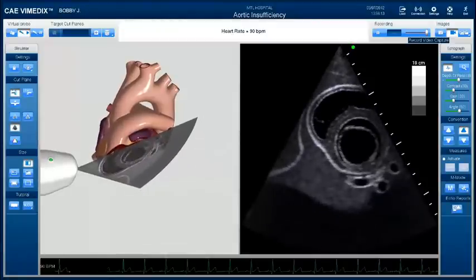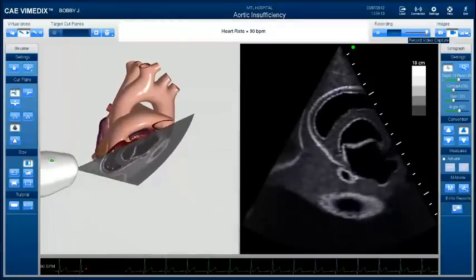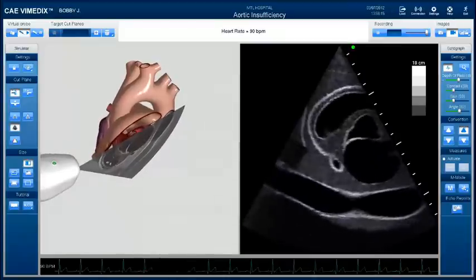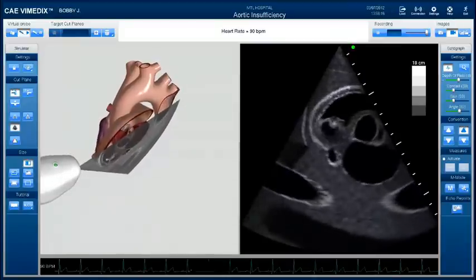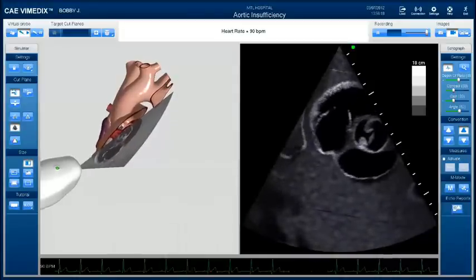So that's the mitral valve, that's wide open right there, that's it closed. And we're moving up and we're going to get to the level of the aorta right now. I'm going to pause it here and draw for just a second so you guys can see exactly what's going on.